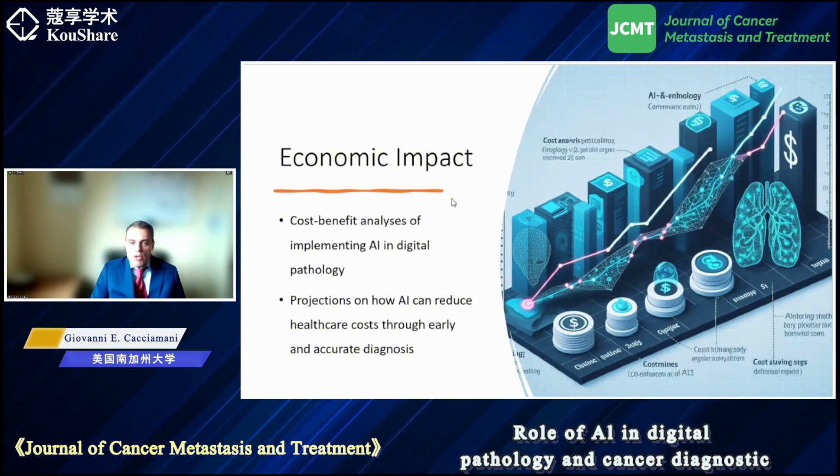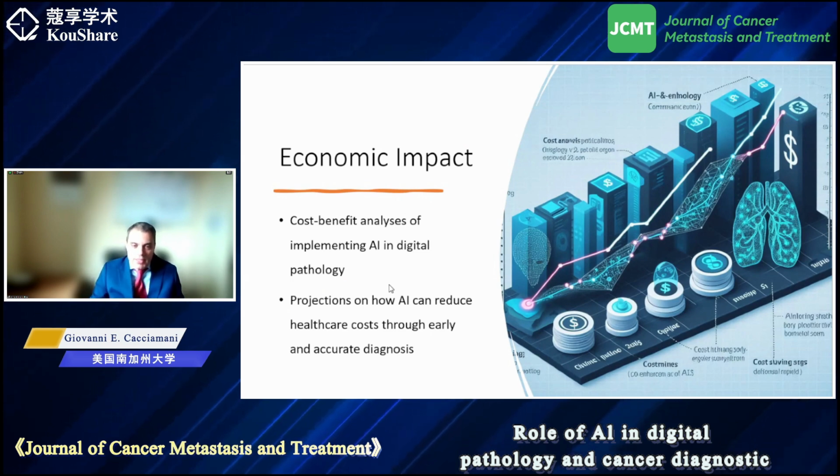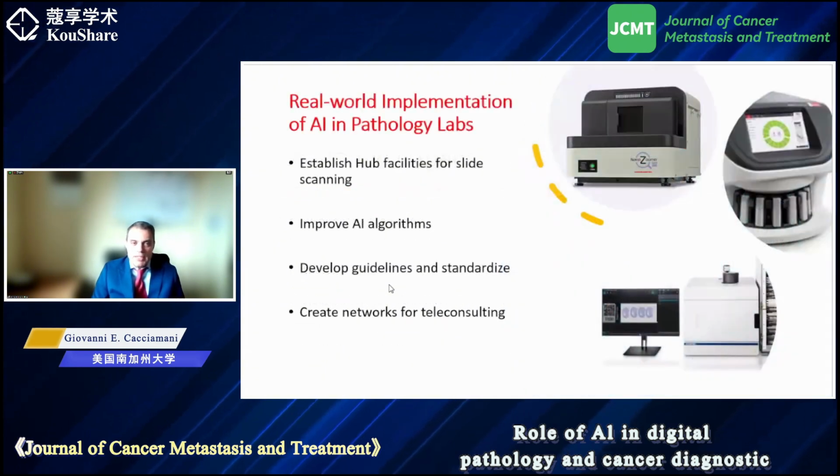Last but not least, the economic impact of artificial intelligence, because if I ask you to start digital pathology today, of course you have to invest in a scanner, for example. You have to buy a scanner, they are quite expensive, but we could consider a projection in which this investment will translate into an advantage in the future, because slides are then scanned, and you don't need to store the slides materially. By the way, you should pay for storage of your gigabytes, but you can share, you can develop, and I think in the long term, there would be an economic advantage.